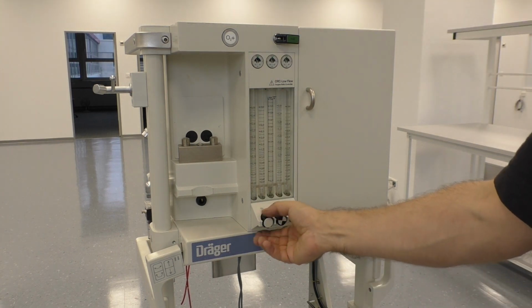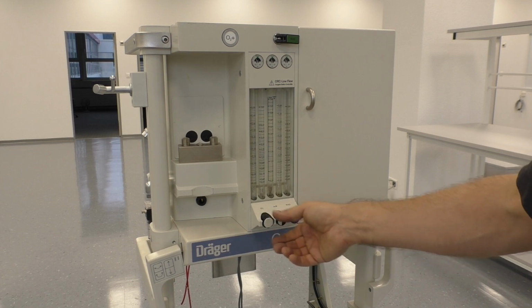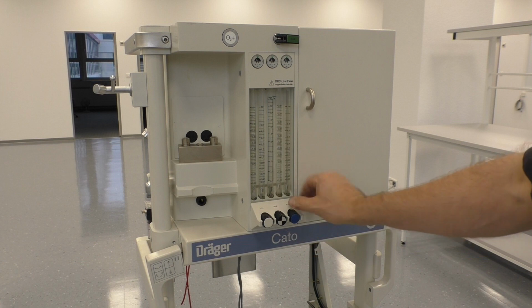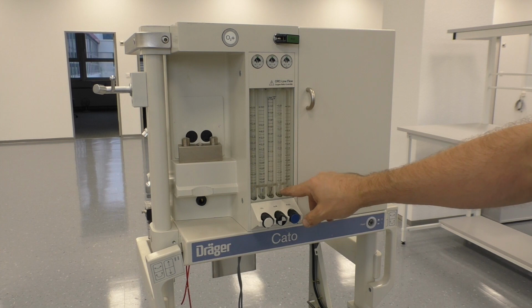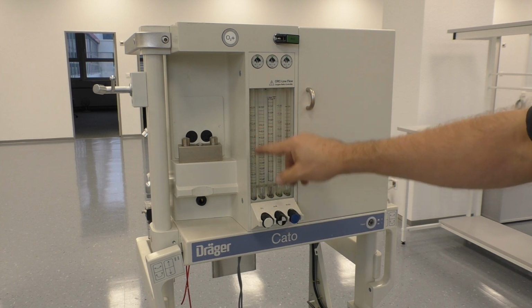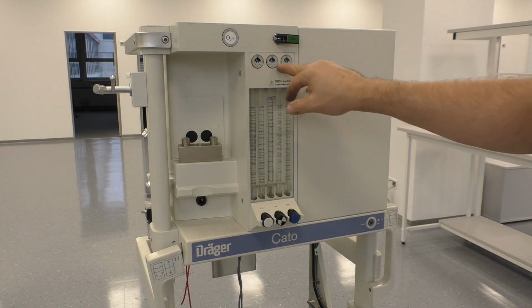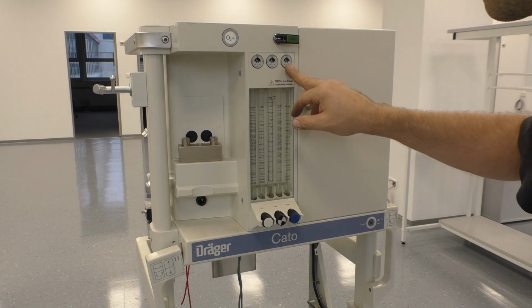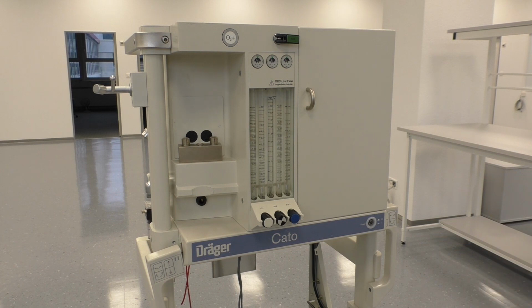Then you have here variable regulators for O2, oxygen, air, and nitrous oxide with the flow indicator here. That's a little piston that moves up depending on how much air you blow through that tube. There are 3 nice little pressure gauges. Okay, let's see inside.